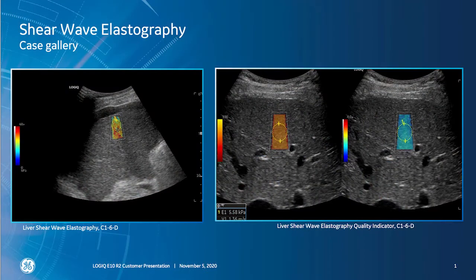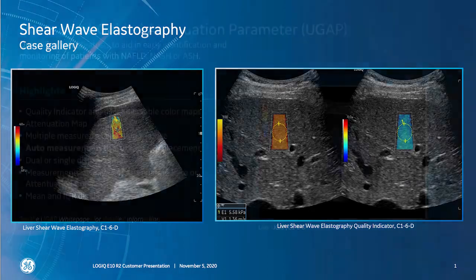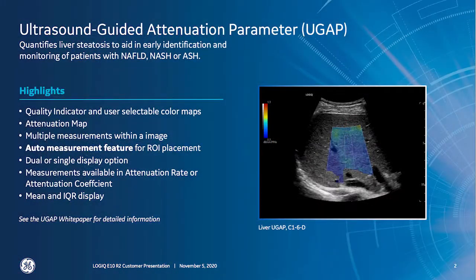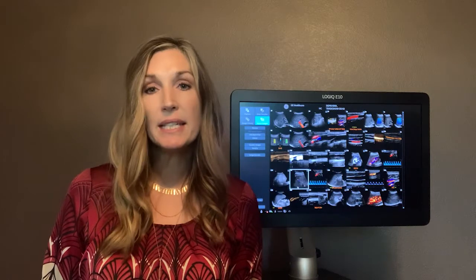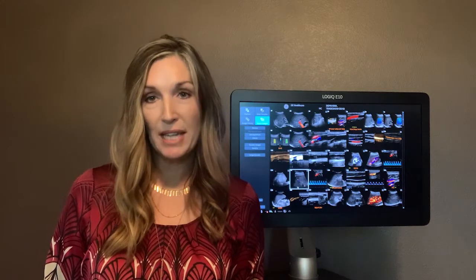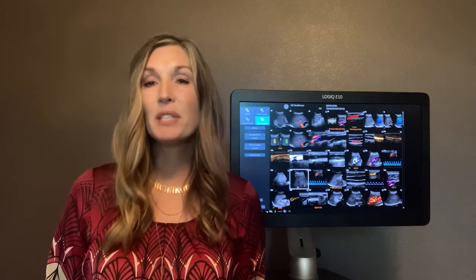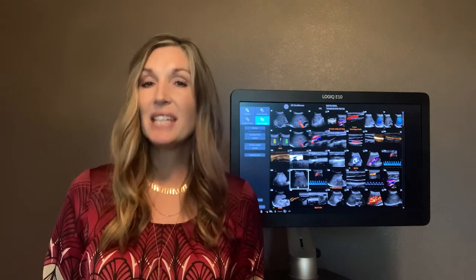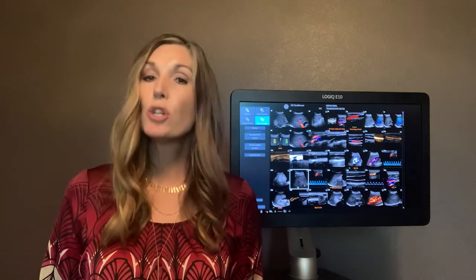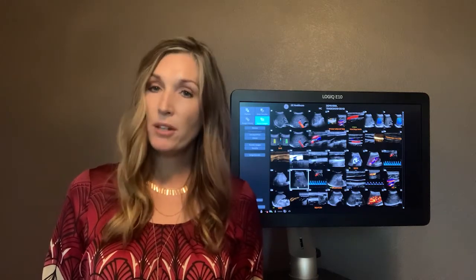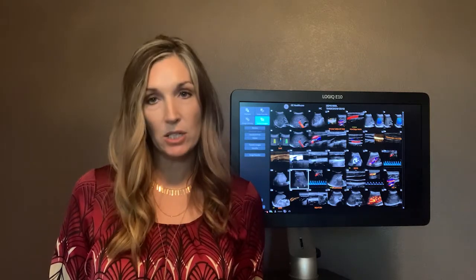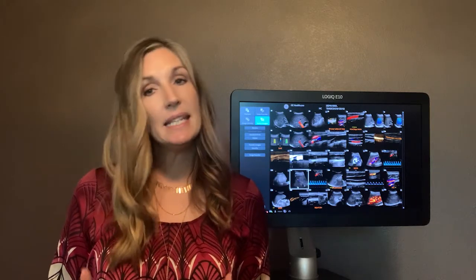Comprehensive advanced tools like 2D shear wave elastography, ultrasound-guided attenuation parameter, or UGAP, and contrast-enhanced ultrasound enables clinicians to diagnose, treat, and monitor a wide range of liver conditions.